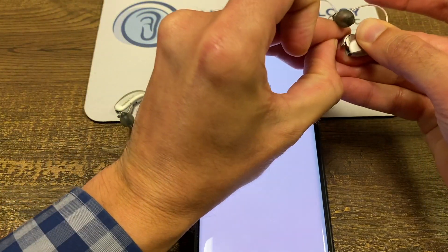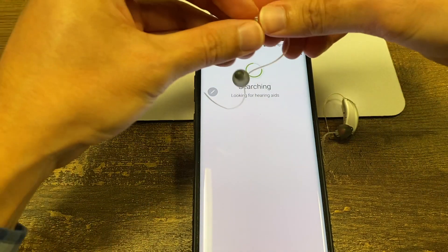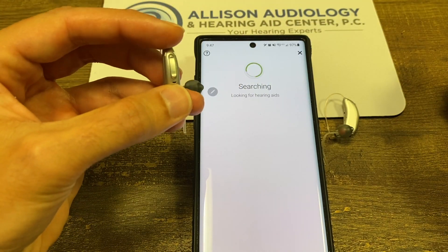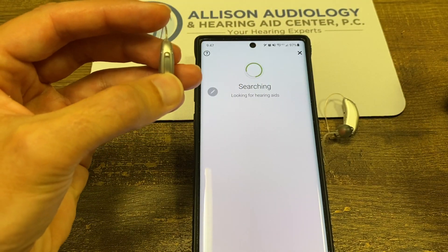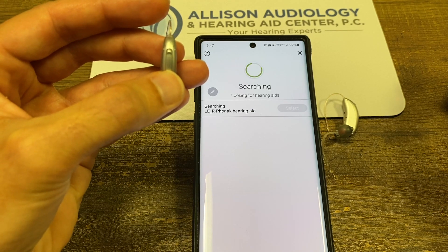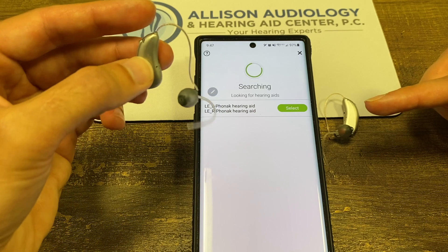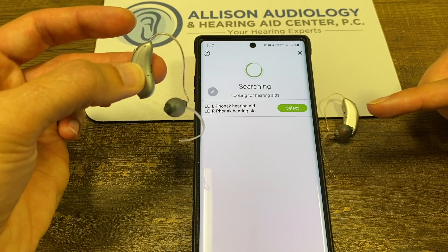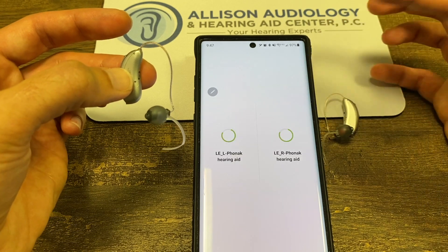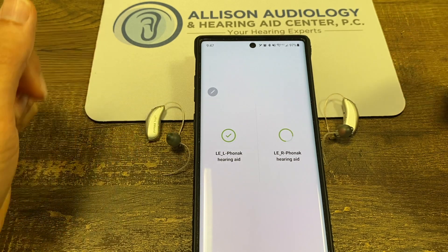These have batteries, so we're going to open the battery door again and close it — put it right next to the phone to make it quicker. Again, if you have the rechargeable ones, you hold the bottom button for about five seconds to turn it off, then hold it again for five seconds to turn it back on. You would have to reboot both hearing aids if you have the rechargeable. All we had to do with the battery ones is open and close in about 10 seconds, and it found the hearing aids. We're going to connect to them and put them close to the phone.